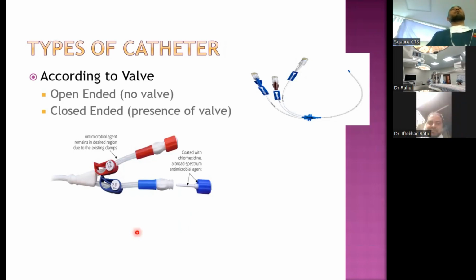Another type is according to valve: open-ended. We always use this open-ended catheter, but in case of dialysis, they use closed-ended, which has the presence of a valve. This is the closed-ended catheter.